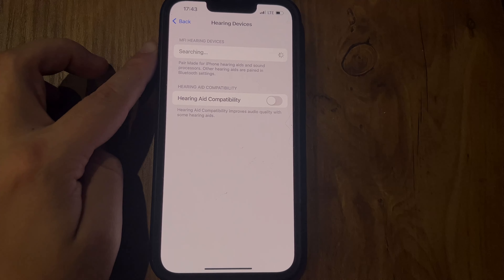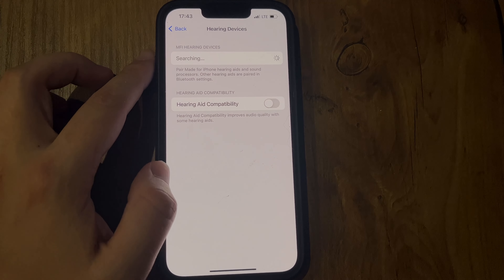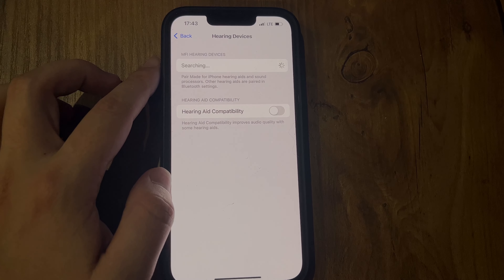When their name appears below MFI Hearing Devices, tap the name and respond to the pairing requests.